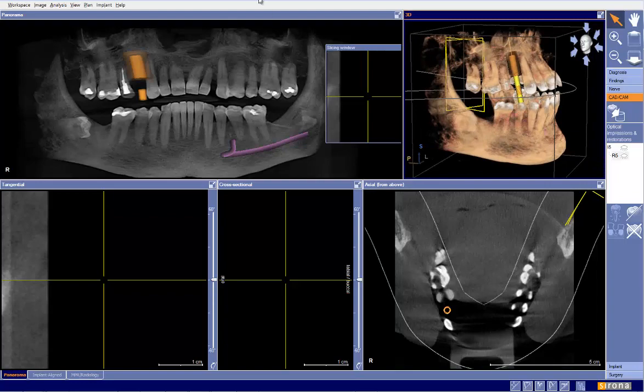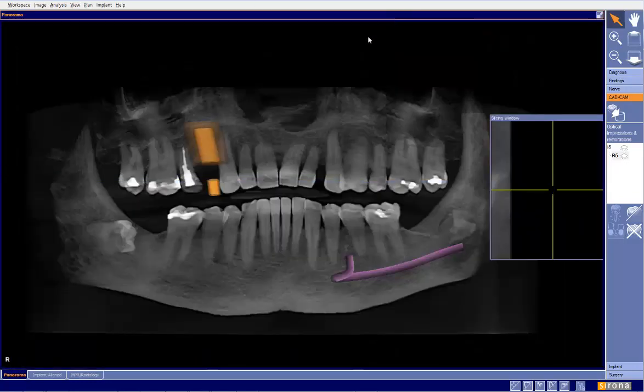So in this particular case, the first thing I always ask is, when we look at this, we're missing tooth number 5. My first question I'll ask myself or the attendees is what type of surgical guide we're going to use. And this is an Opti guide through and through. There's very little metal artifact. We've got plenty of natural teeth to work with.